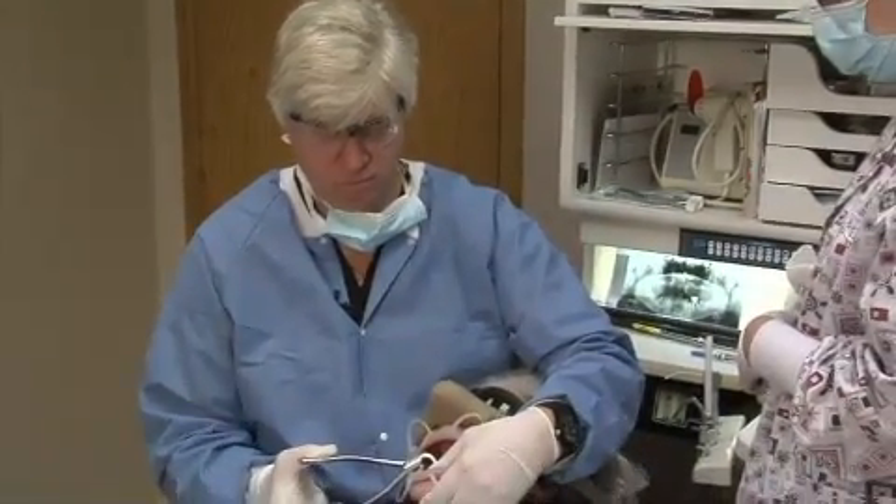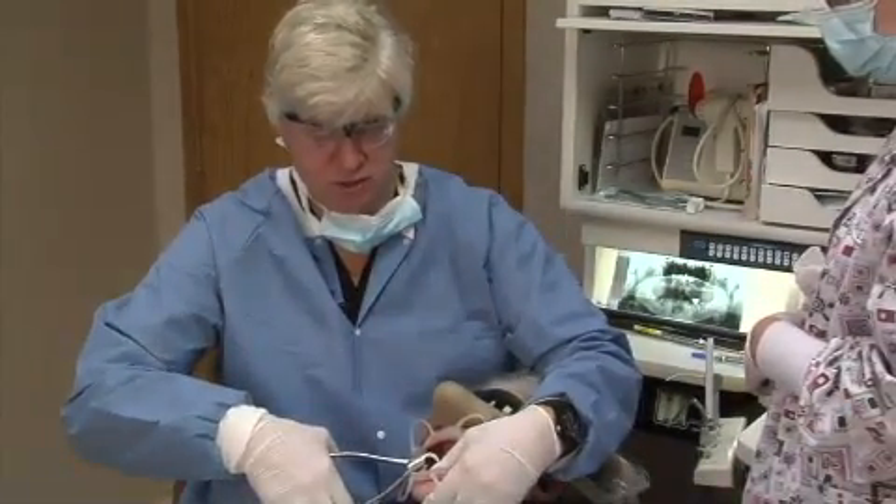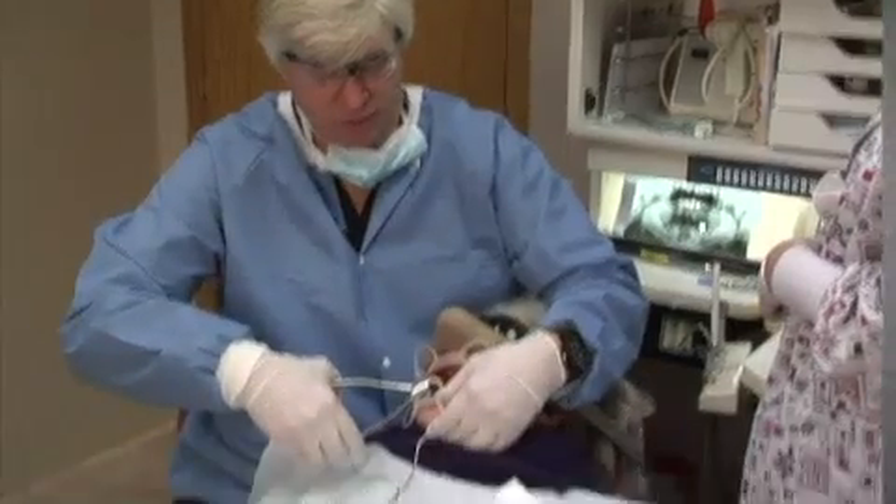I've been practicing for a long time, and I can't tell you how many times I've heard a patient tell me that the doctor put their knee on their chest, but I've never seen that. But those days are gone. Again, I'm just using two fingers, or a finger and a thumb really.